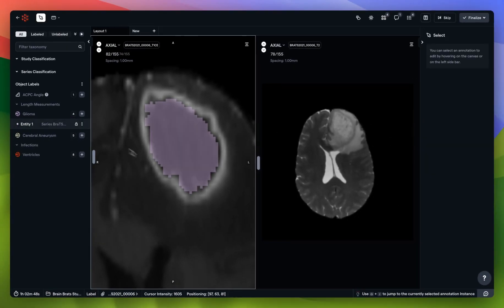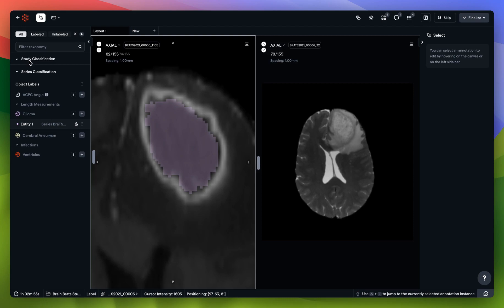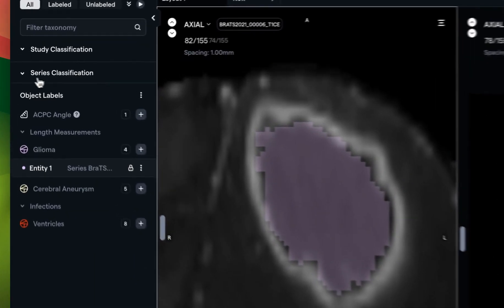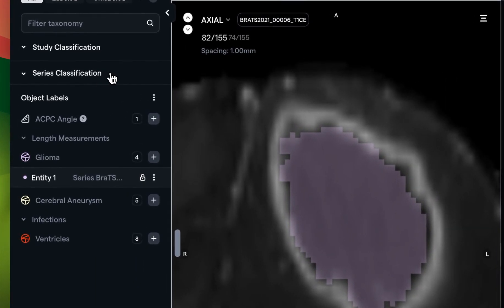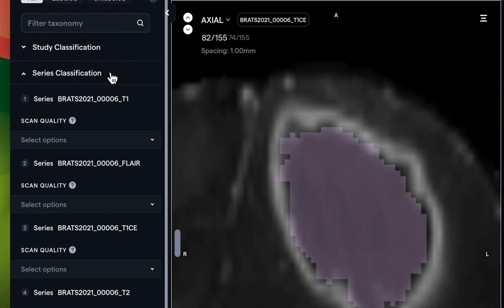One of the other things that your admin might ask you to do is also make certain types of decisions based on the series that you're looking at or the study. In this case, we do have a series classification, so let's give a click and see what we have.